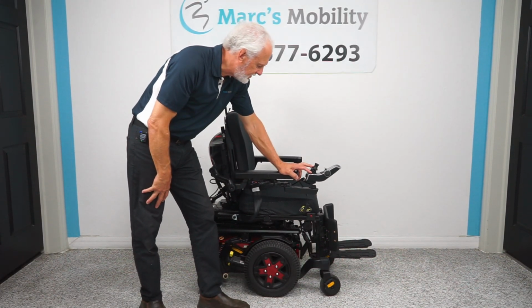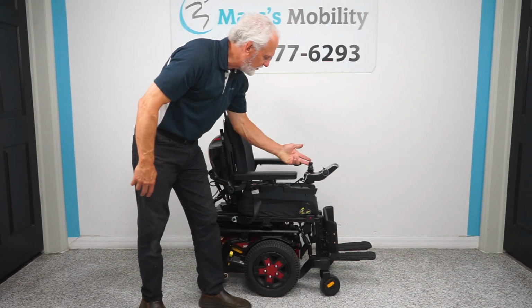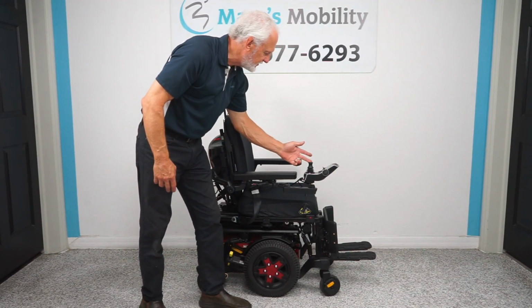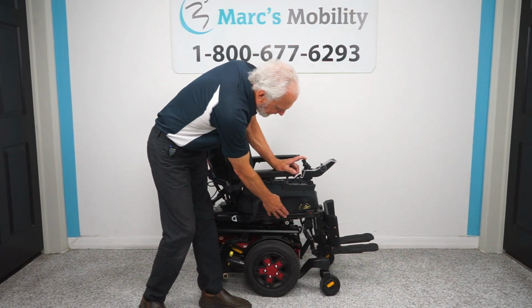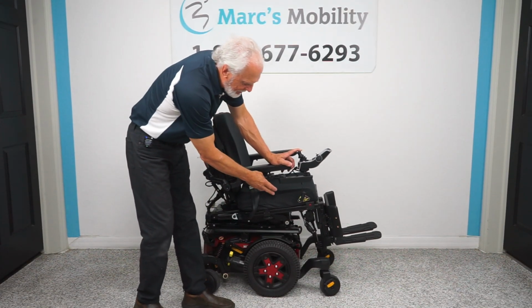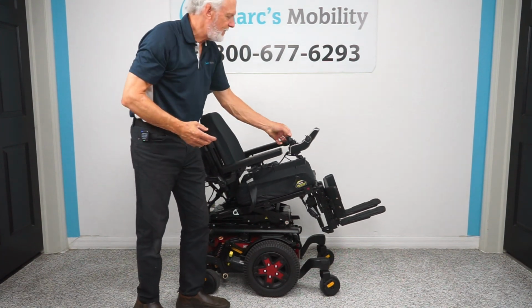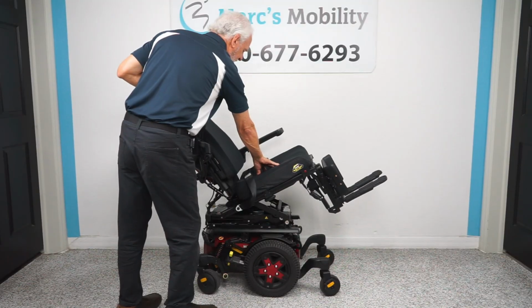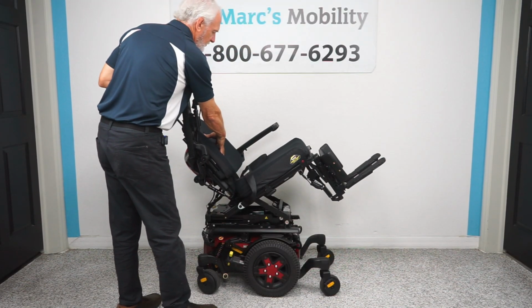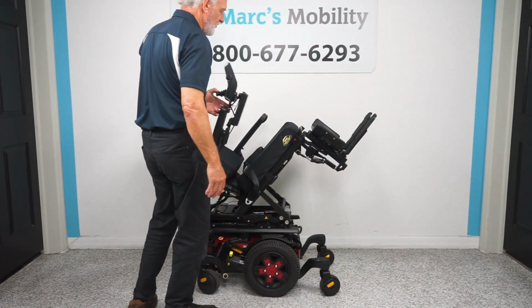Okay, so for the electric tilt you want the bottom cushion and the back cushion to be yellow. So I'm going to go to 2 yellow cushions and I'm going to push it back like I did earlier. But now you see the bottom goes back. When that happens, your legs and your back go with it because they're all connected together. This has a lot of medical benefits. If you need to relieve pressure off your bottom, if you have bed sores, pressure off your back, or you just want to have circulation, this is a good way to have circulation also.